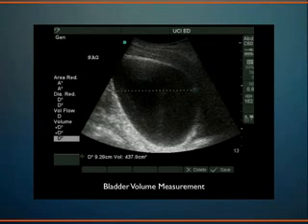Somebody who has an enlarged prostate thinks they've emptied their bladder, but instead we have 400 cc's left in the bladder after they attempt to void. Their post-void residual, 400 cc's, is a lot of good information to pass along to a specialist like a urologist. And we can also measure their prostate too. On transabdominal bladder ultrasound, we can measure the dimensions of the prostate.